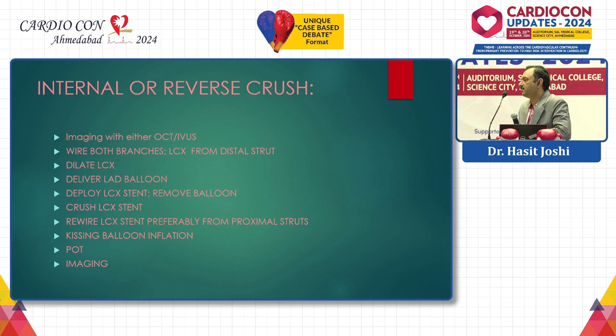So now probably we will consider this as 111, and we'll consider this lesion as unfinished business from the first procedure. There are 2 ways to approach this. One is provisional stenting. Consider this 001, then we would do provisional stenting from LMCA to LCX crossover, stent that portion, and then dilate the LAD as a side branch.